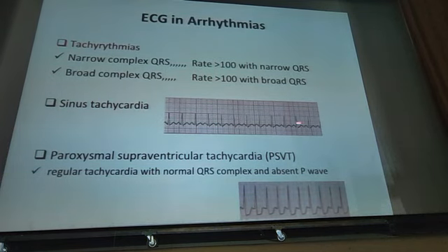Okay, this is sinus tachycardia. How do you know? How could you recognize if it is sinus or not? How could you differentiate from other serious abnormalities?